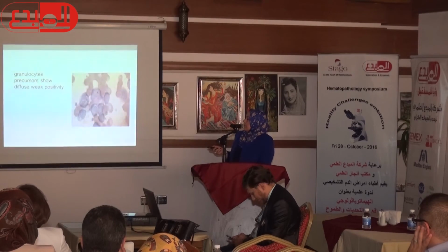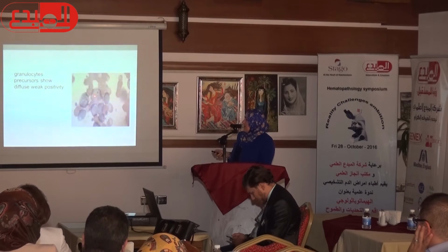Granulocyte precursors show diffuse weak positivity. This is a case of ALL, and there are some remnant granulocyte precursors which show a light pink stain.